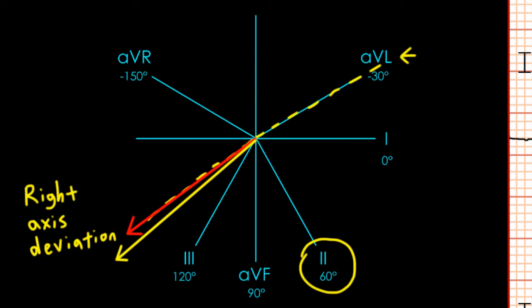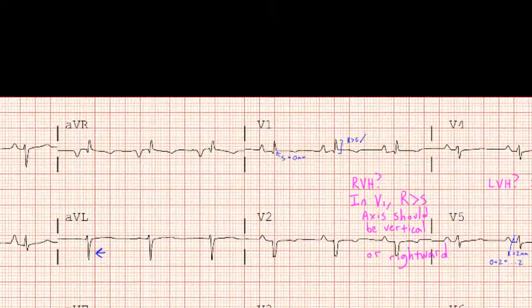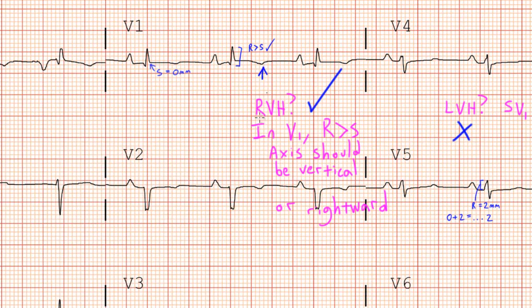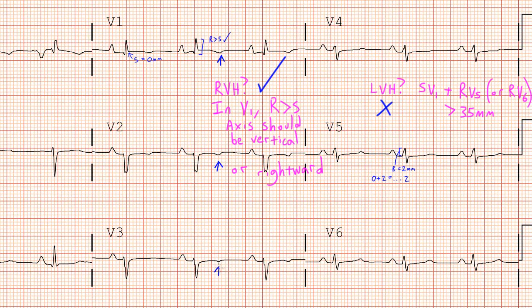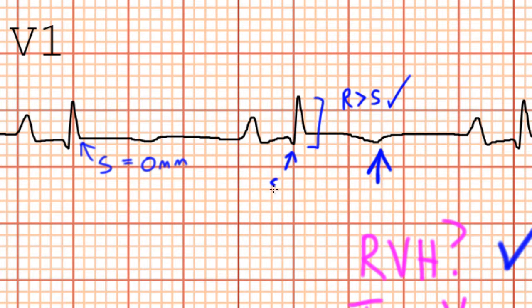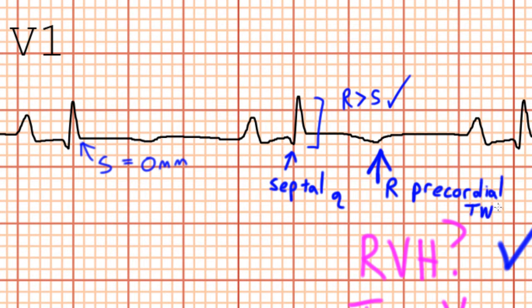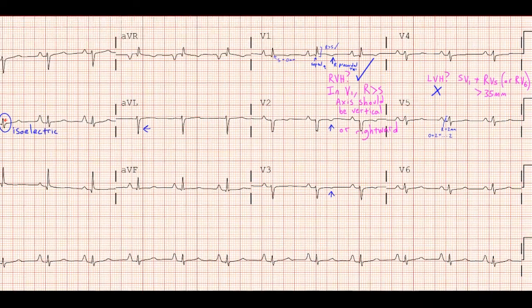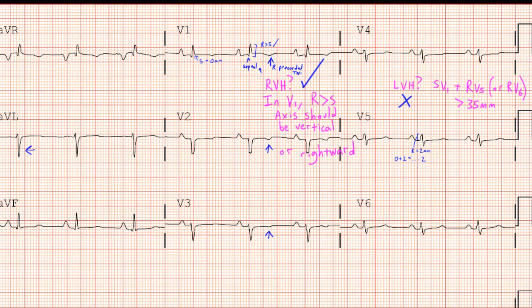Because we have R greater than S in lead V1 and right axis deviation, we can say that we have signs of right ventricular hypertrophy. Even more suggestive of RVH are these small T-wave inversions in the right precordial leads — V1, V2, and V3 — and this tiny septal Q-wave preceding the R-wave in lead V1. Patients with predominant pulmonary disease tend to have QRS complexes that are smaller, particularly in the precordial leads, in contrast to someone with RVH due to primary pulmonary hypertension or mitral valve disease. This patient has QRS complexes that are pretty small with generally poor R-wave progression, consistent with severe pulmonary disease.